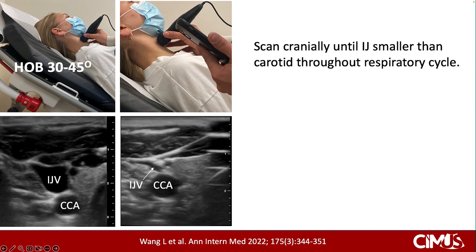To do the examination, elevate the head of the bed between 30 and 45 degrees. Have the patient position their head slightly leftward in a neutral position. Find the transducer above the clavicle, identify the internal jugular vein, and follow it cranially until it tapers smaller than the common carotid artery throughout the respiratory cycle.